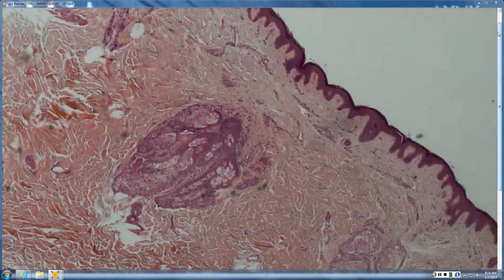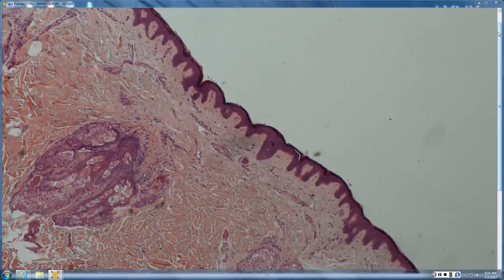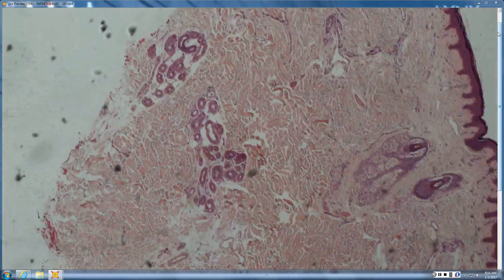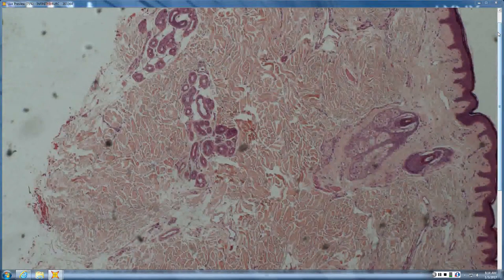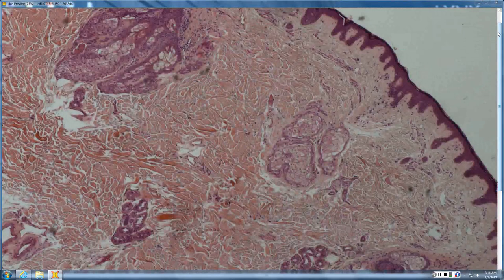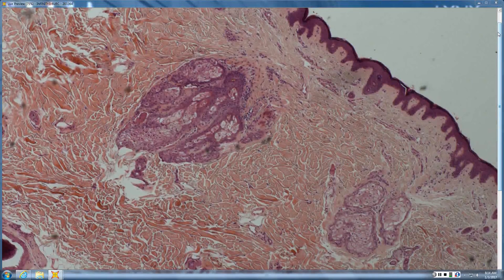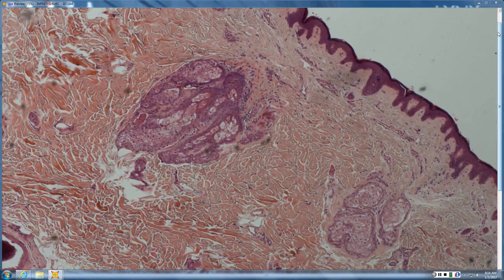This one was actually a biopsy done during chemo. I don't see a lot of terminal follicles. You'd expect to see them, just with matrix shutdown. Given that the biopsy was done, this person probably had pattern alopecia that was advanced, and with the chemo, they lost some hair cycles, and so they've accelerated their pattern alopecia. That's one of the things you see with people who've had multiple episodes of chemotherapy. It's robbed you of the normal hair cycles that you were supposed to get.